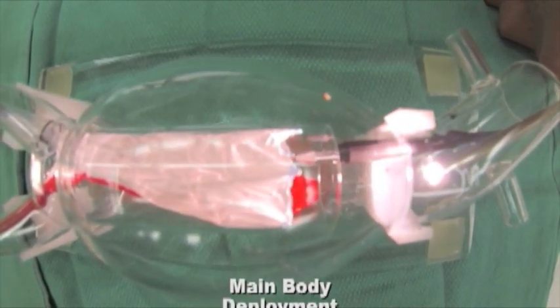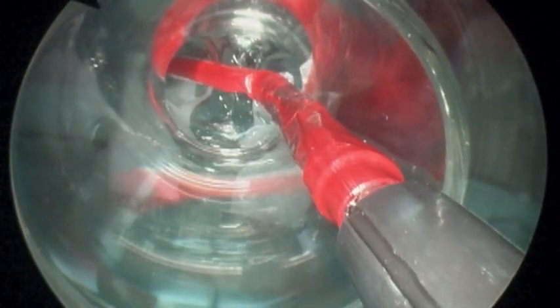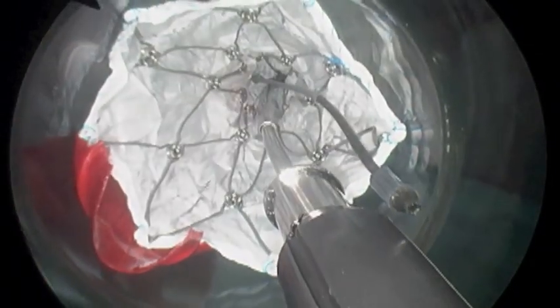Here you see the main body of the stent being deployed. Similarly, this is the scene from the inside of the plastic model — the bifurcated unibody stent is positioned and then deployed.